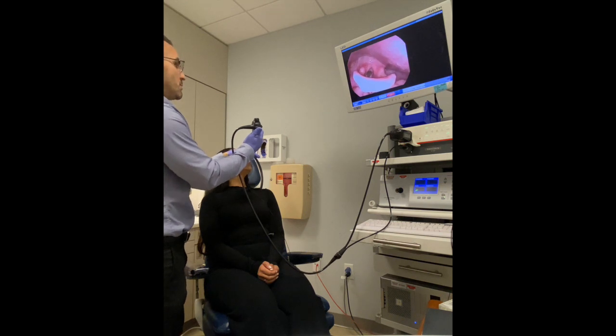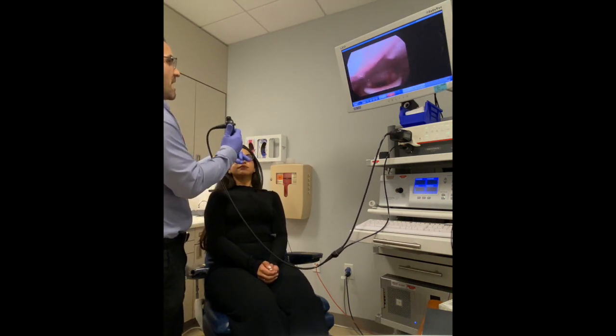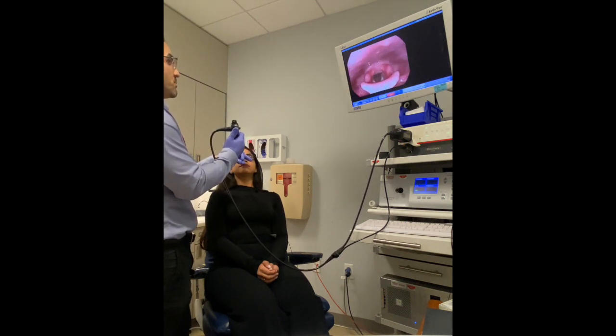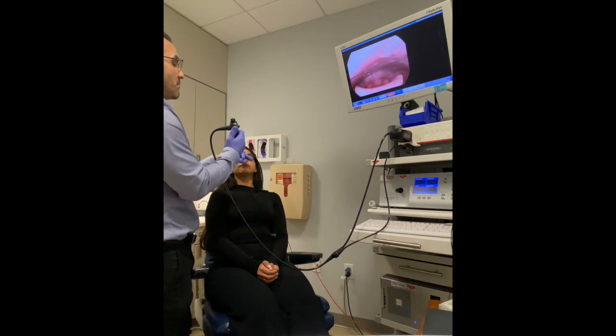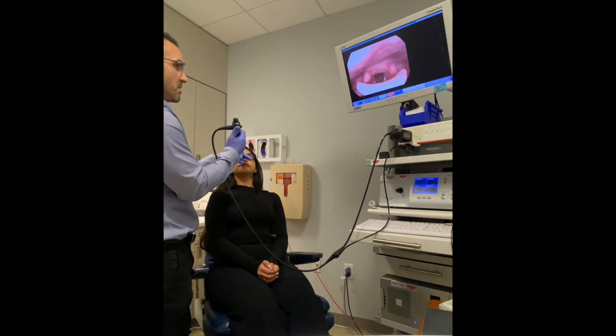I'm going to have you turn a little more towards me — don't look at the camera anymore. I just want you to do the breath hold. Whenever you're ready, go ahead and hold your breath lightly. And relax. — Did you close it? — Let's do it again. Hold. Two. Three. Relax. — Did you do it? — Yeah. — A couple more. Hold. Two. Three. Relax. — Did you do it? — Yeah. — All three of those, you did it.